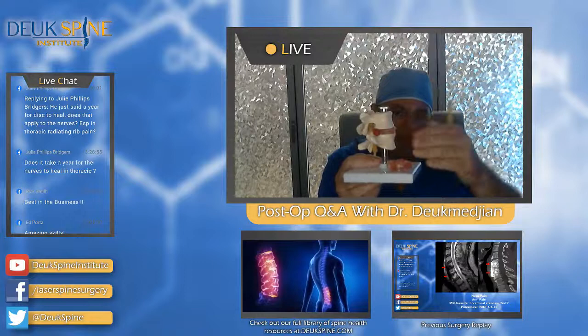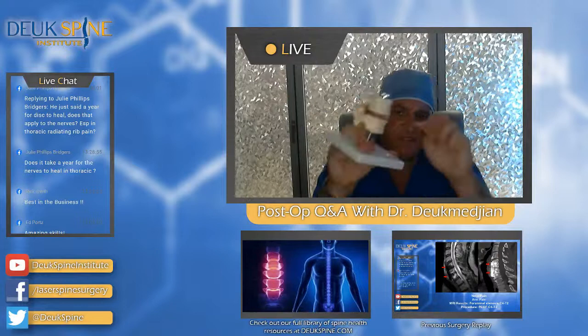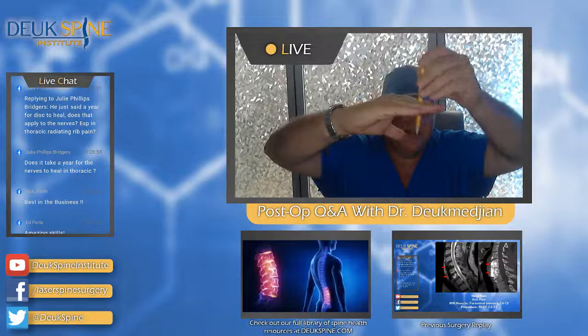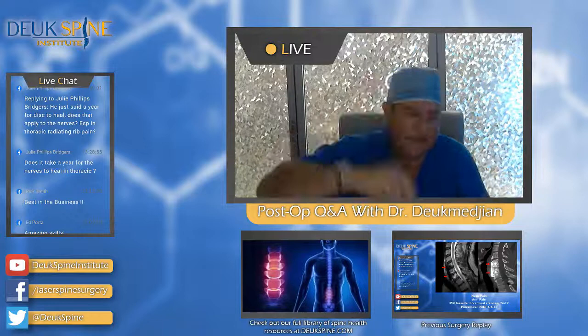So what I'm doing is I'm literally spreading the fibers open in the front of the disc, and as I go in with the pencil to the front of the disc, it literally pushes the fibers apart. I go in and do the surgery down here like this, and then I take this out and the fibers close. So that's what the disc looks like after I leave. It is totally undamaged.